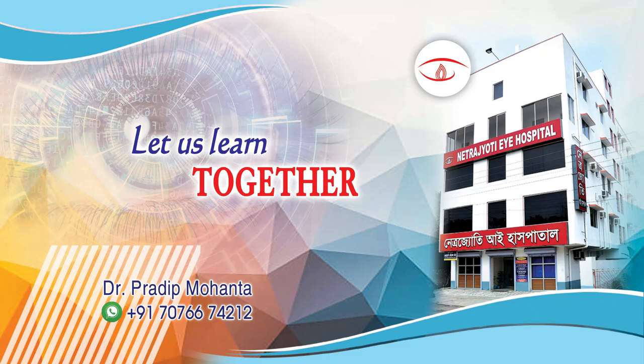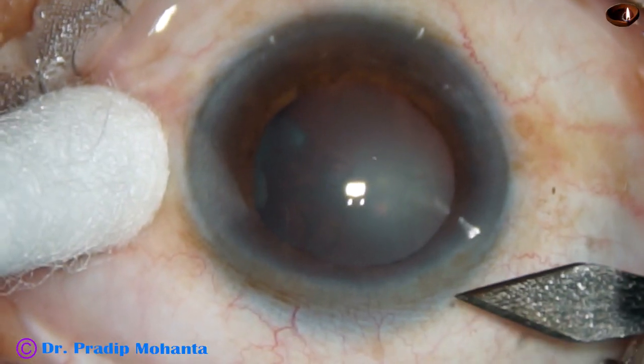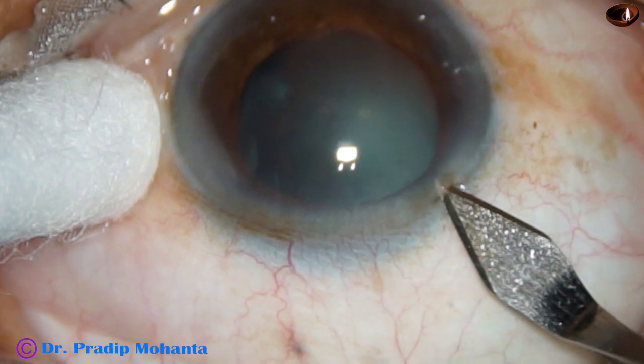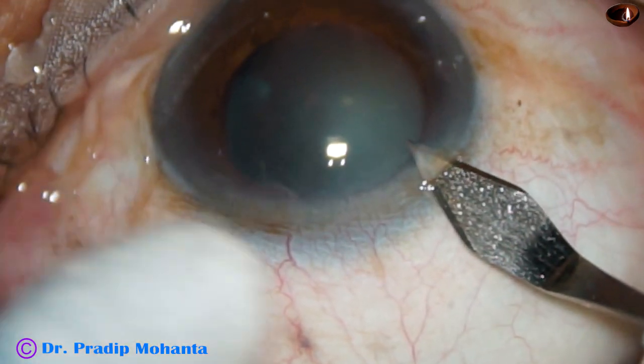Welcome to my workplace at Ranakhat, West Bengal, India. This is an edited video of a subluxated cataract. The subluxation is from 12:30 o'clock to 5 o'clock.